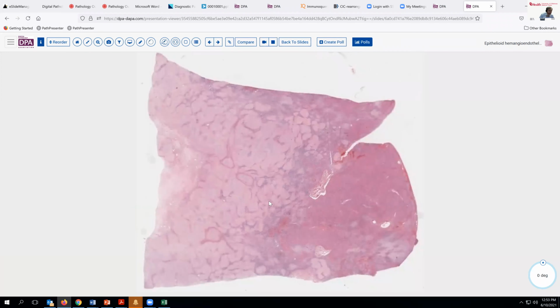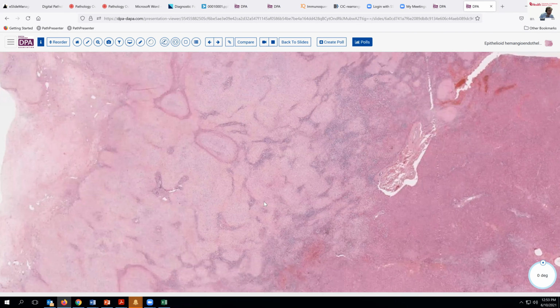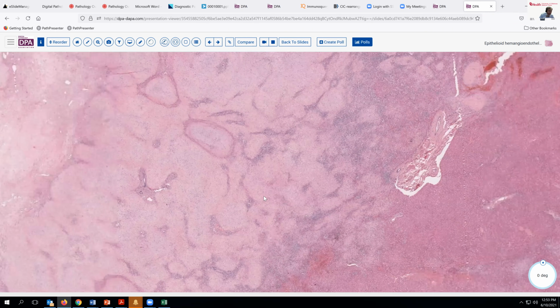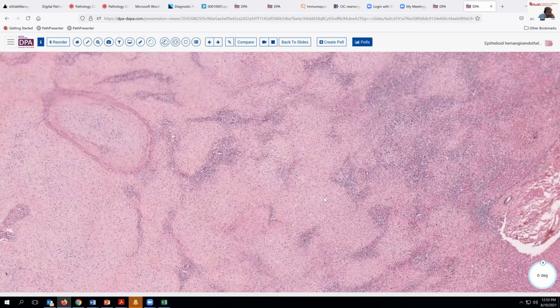This lesion, more uncommon, may involve multiple sites in the liver as well as elsewhere. This is the epithelioid hemangioendothelioma. And because this lesion doesn't really look like a vascular lesion, I think you should come back and study these lesions fairly carefully, because should you get a needle biopsy of this, it could be quite challenging.